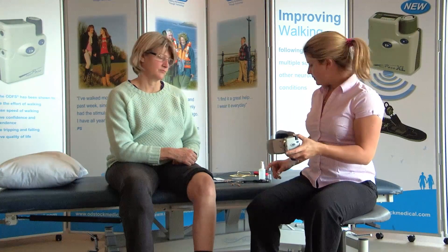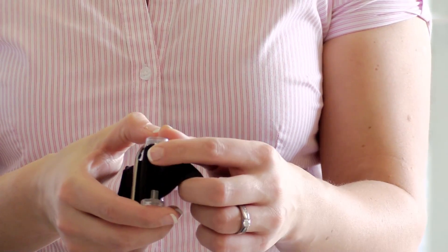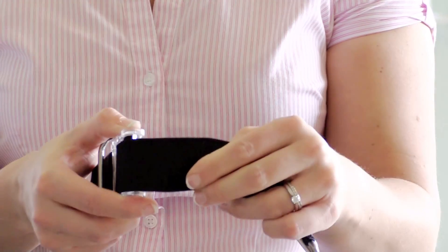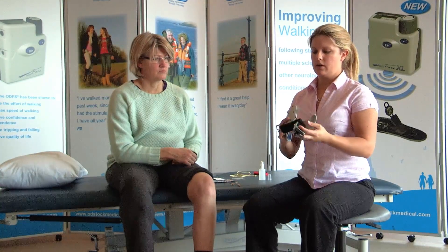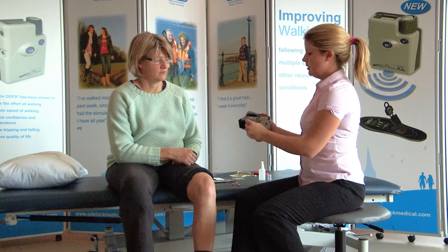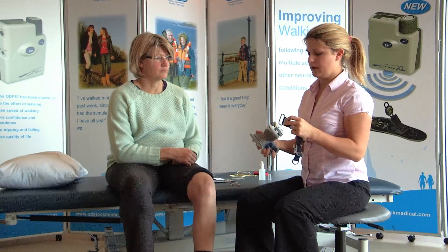Now you're ready to set up the strap. Place the leg cuff down and make sure you open up the leg strap before fitting it. Be aware there are two plastic lugs that hold the strap in place — before adjustment, take the strap out of the lugs, and once you've finished adjusting, place it back in. The leg strap can go either from the outside to the inside, or from the inside round to the outside. The label always faces the inside, towards the leg cuff.